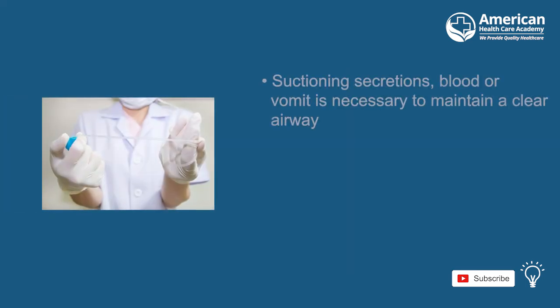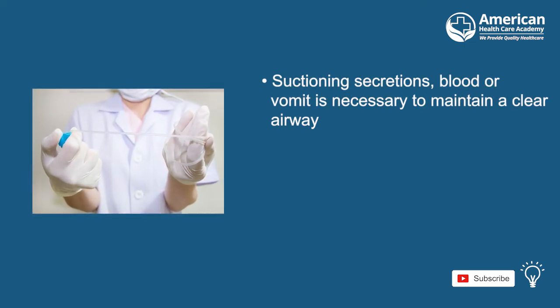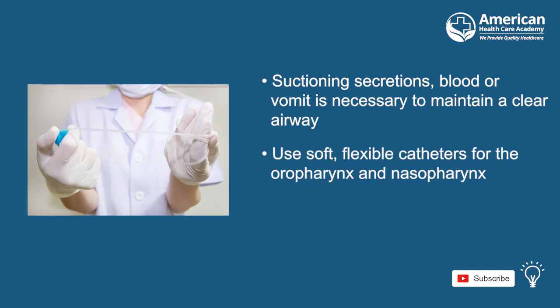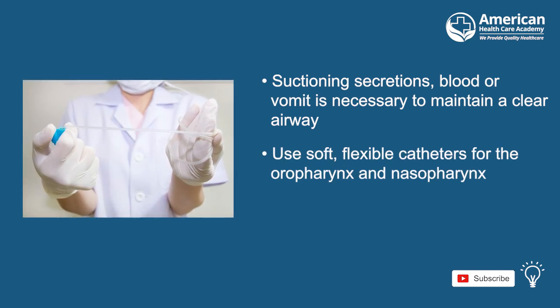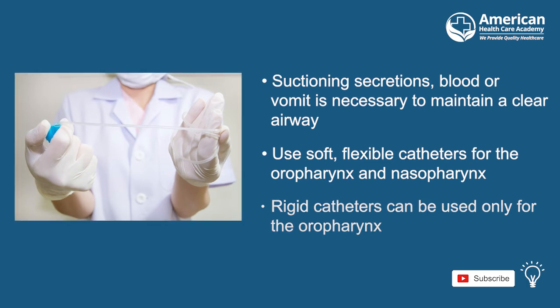Suctioning is also necessary to maintain a clear airway in the patient by removing secretions, blood, or vomit. When suctioning, use flexible catheters for the oropharynx and nasopharynx, and use rigid catheters only for the oropharynx.